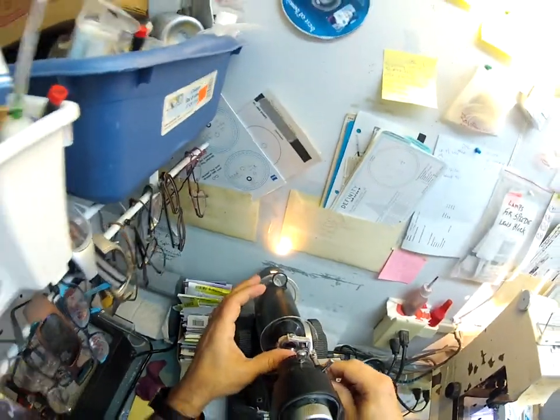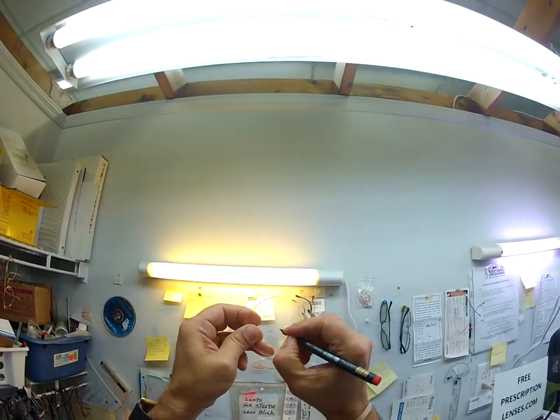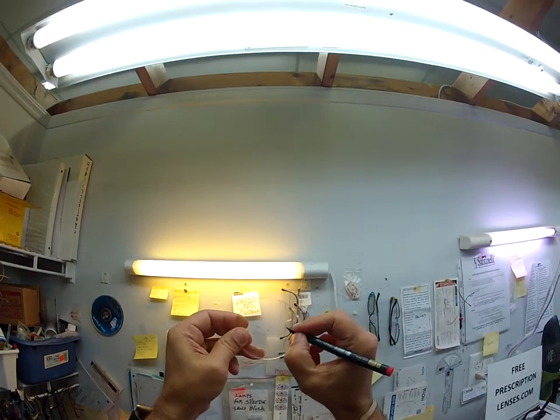The sphere powers are perfect. Check your astigmatism, which is 2 steps. We're good there. I'm putting 2 red dots on there, which you can't see, so I'm going to darken those. I really need to get some more ink for my lensometer. And that is the right lens.